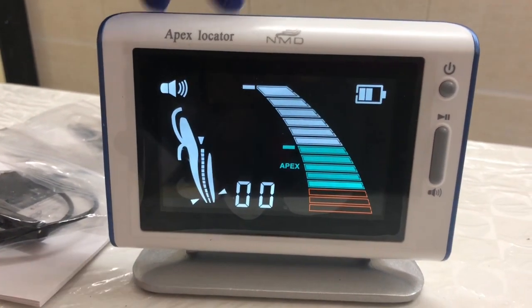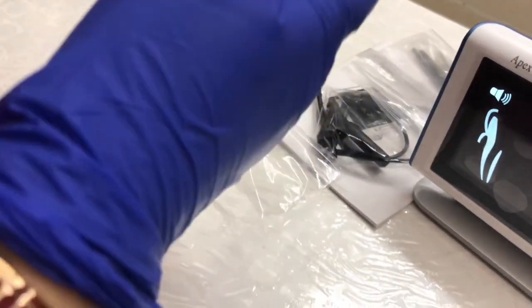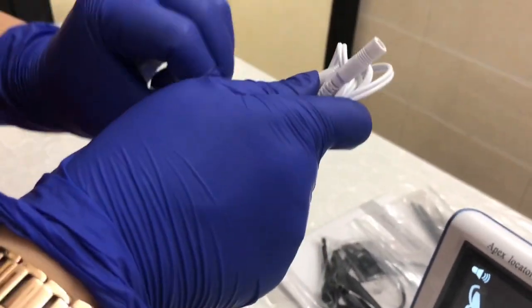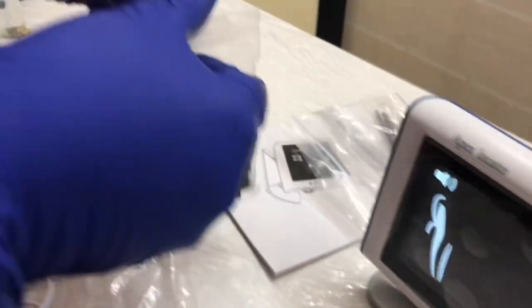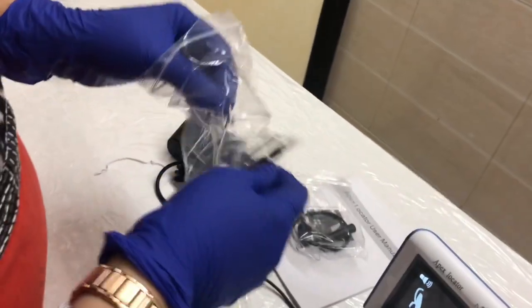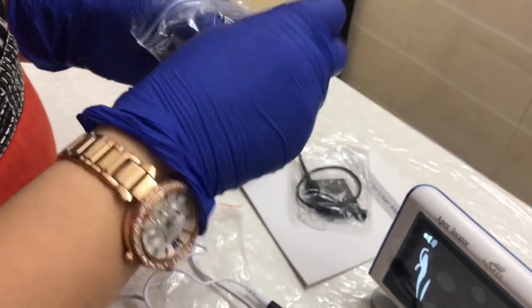Let me show you how it is installed and how it works. We have a small model here. First, we are going to connect this measuring wire to the device, and then add your lip hook to the measuring wire.